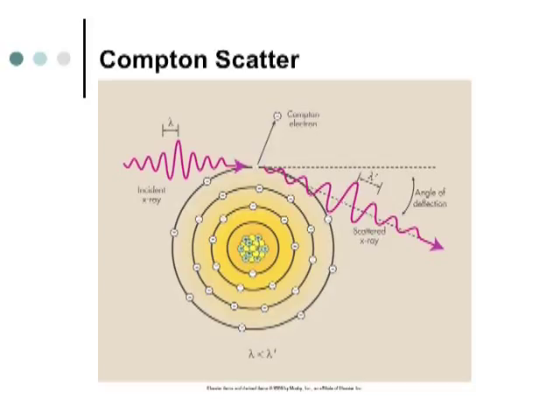Okay? So when we're standing in a room with the patient doing a fluoroscopic exam or something like that using high kVp, we're getting our exposure from the patient. Okay? Even though that's the person you're trying to help, stay away from the patient. That's your source of scattered radiation. We call it Compton scatter. And the higher the kVp, the more Compton scatter you're going to have.